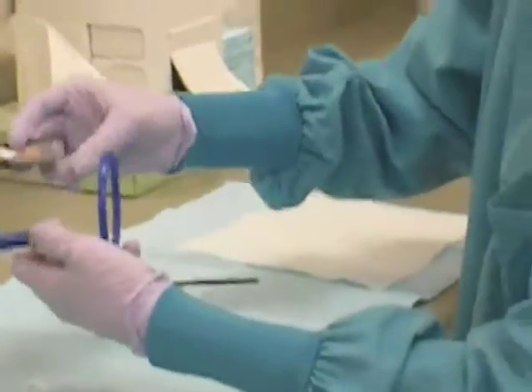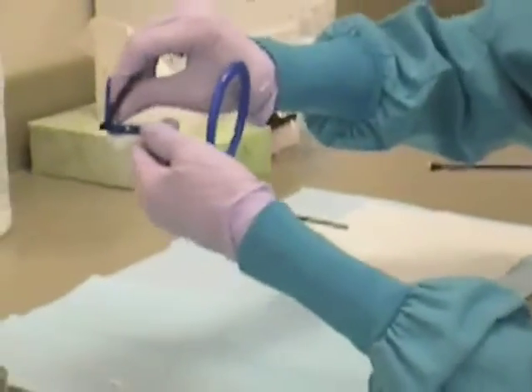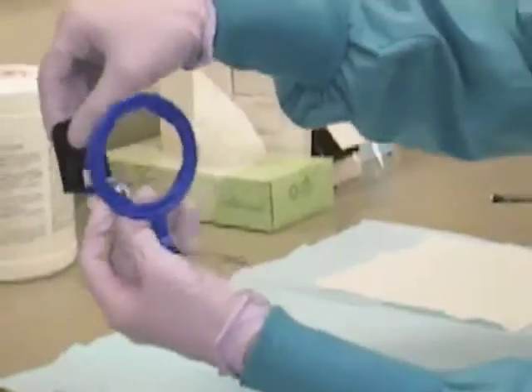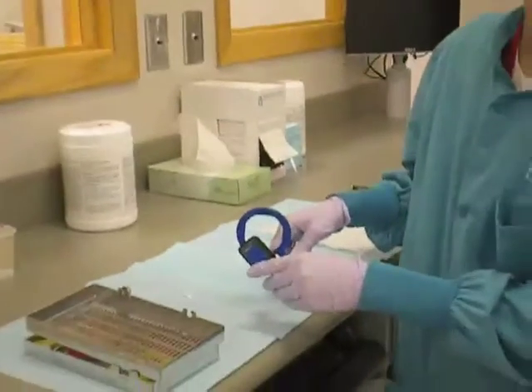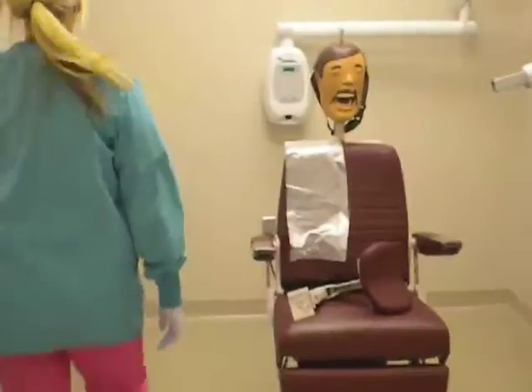Insert the side of the plate with an A on it into the holder on the bite block. Note the copper X must face the patient and the solid black side will face the operator. Now you may retrieve your patient and seat them. Remember, always put the thyroid collar on. If a patient requests, there is a lead apron in the drawer.